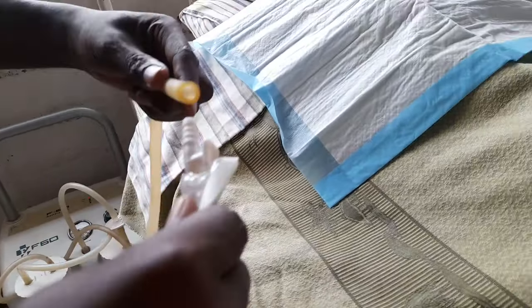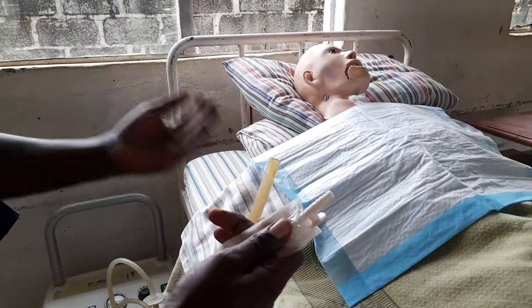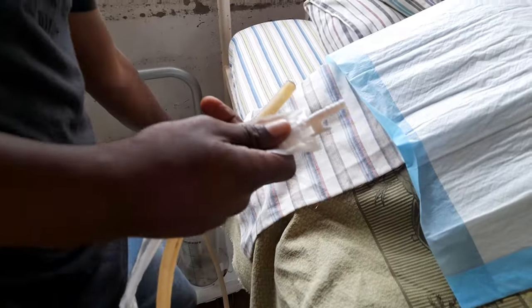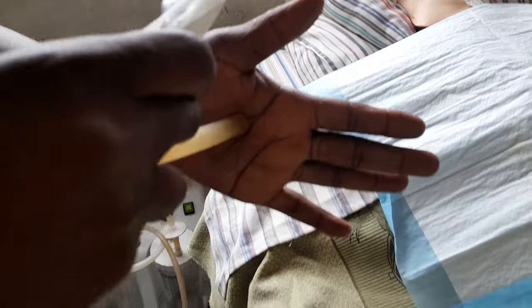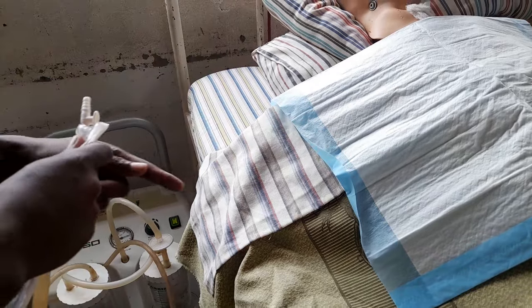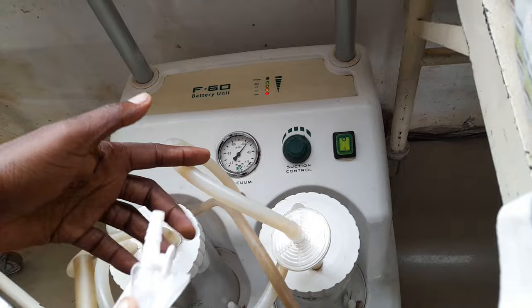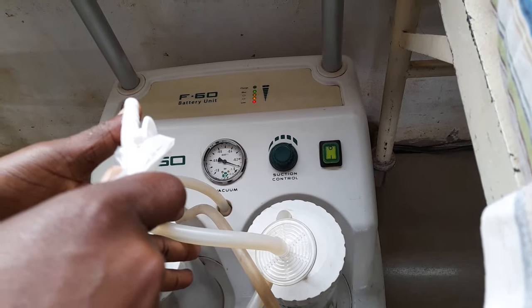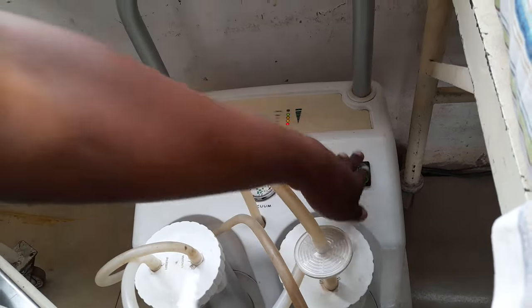Before connecting, show the examiner that you are testing the machine. Switch it on, then block the tube with your finger to test for pressure — watch the gauge rise to confirm it is working. Then switch off and connect the catheter securely.